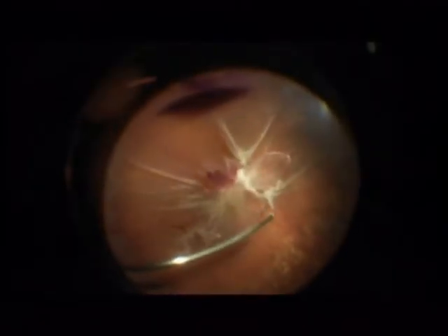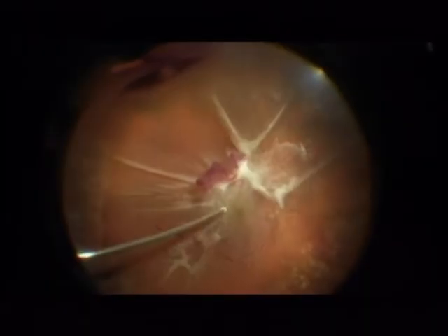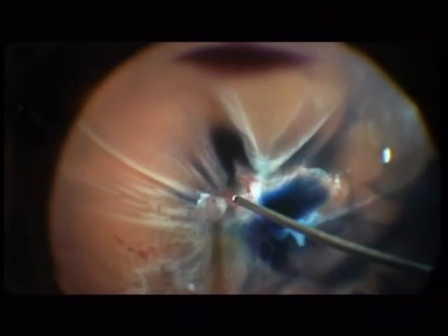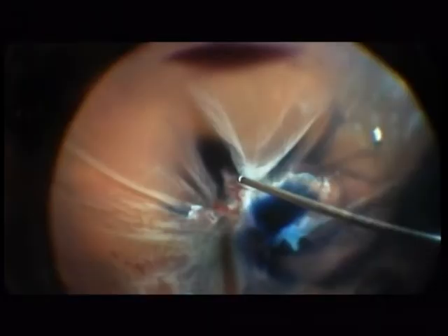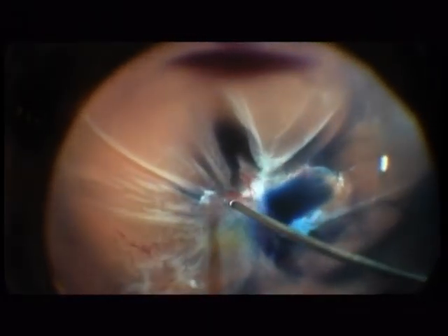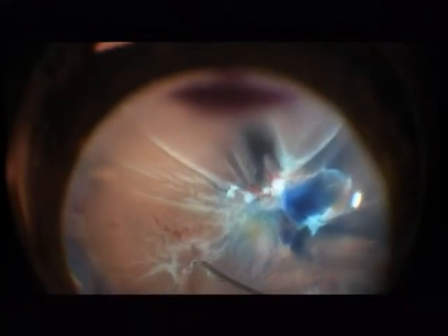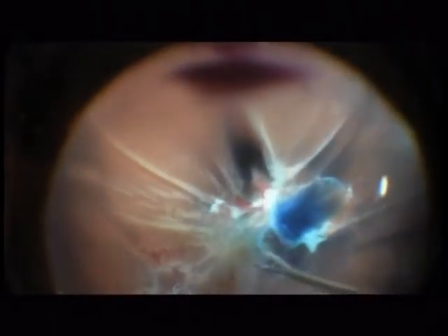Once this is done, we move to the center of the eye and remove the vitreous gel. Here the posterior hyaloid is completely attached, so the next step is to remove the posterior hyaloid at the central pole. I first stained the membranes with Membrane Blue Dual in order to visualize the tissue better. And you see here there is a very thick membrane at the lower arcade. Here are two ruptures, which I diathermized.